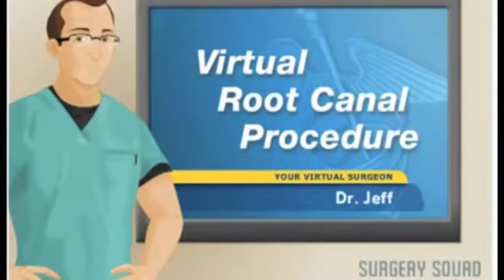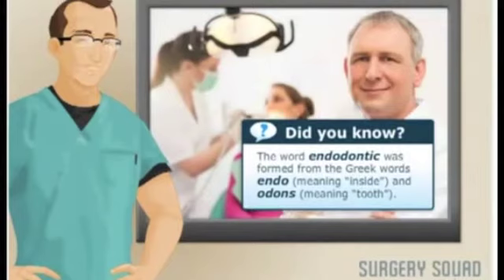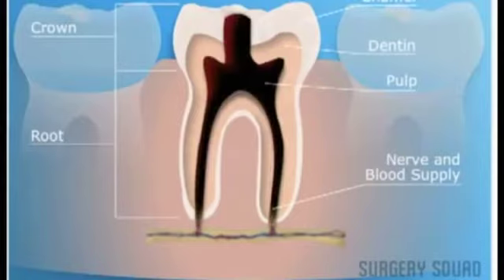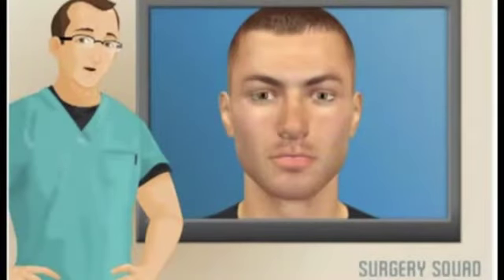A root canal is an endodontic dental procedure that's used to repair and save a decayed or infected tooth. During a root canal, your dentist or endodontist will remove the pulp tissue within the tooth. Once everything is removed, they'll clean out any contaminants inside the tooth and seal it to prevent any further infection. Our patient today is having a root canal performed on their lower right second premolar.